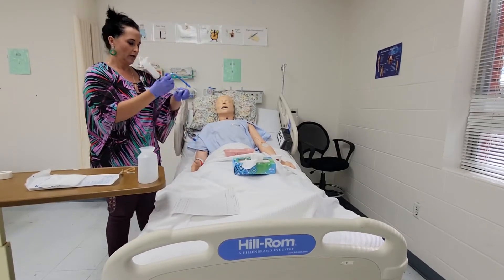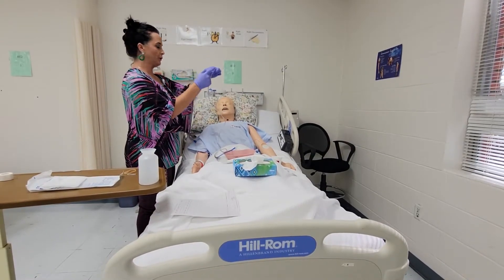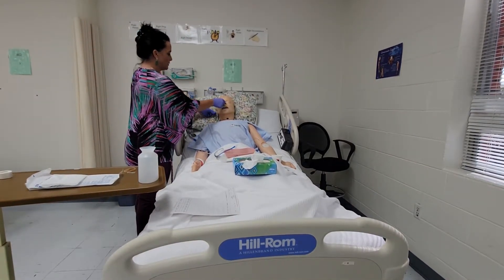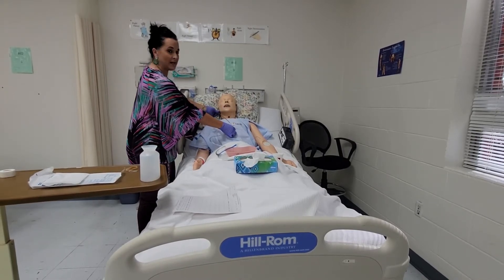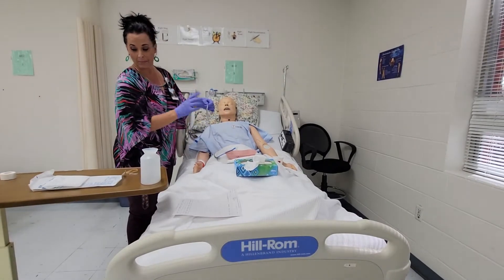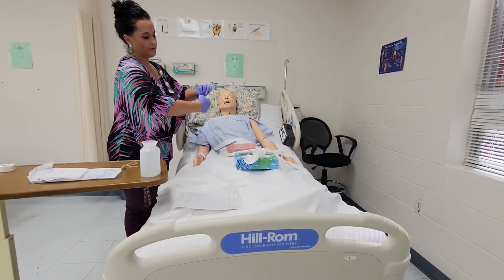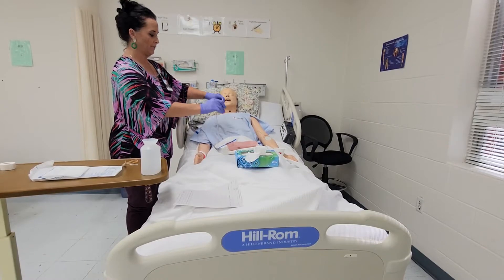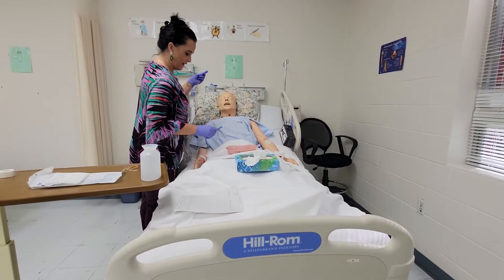We have to measure first. Take the end of your NG tube, start at the tip of their nose, go to the earlobe, then follow down to the xiphoid process. Where my finger is, I'm going to take my small piece of tape and mark the tube — that tells me how far we're going to go down, ensuring it's in the stomach. Everything is set up.